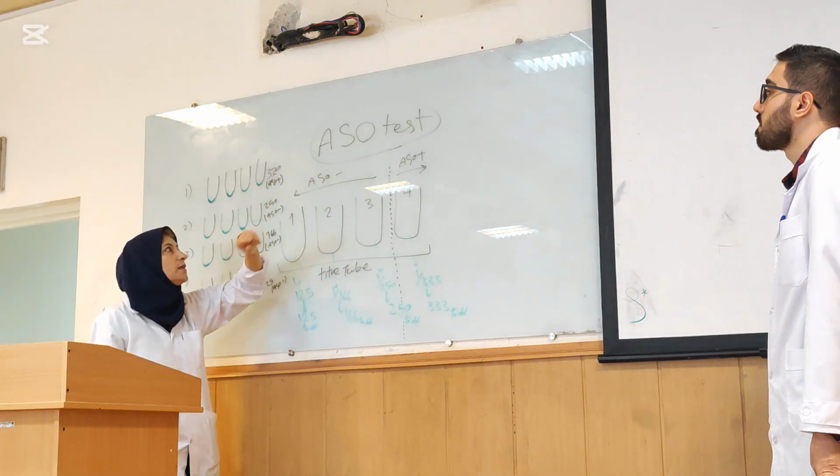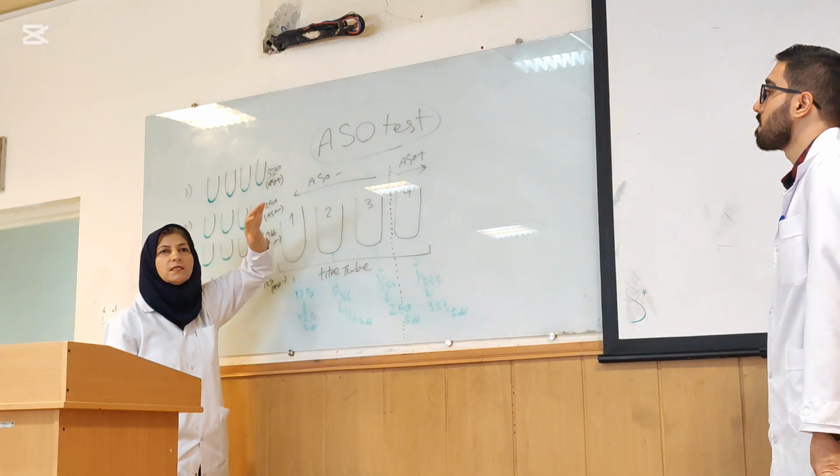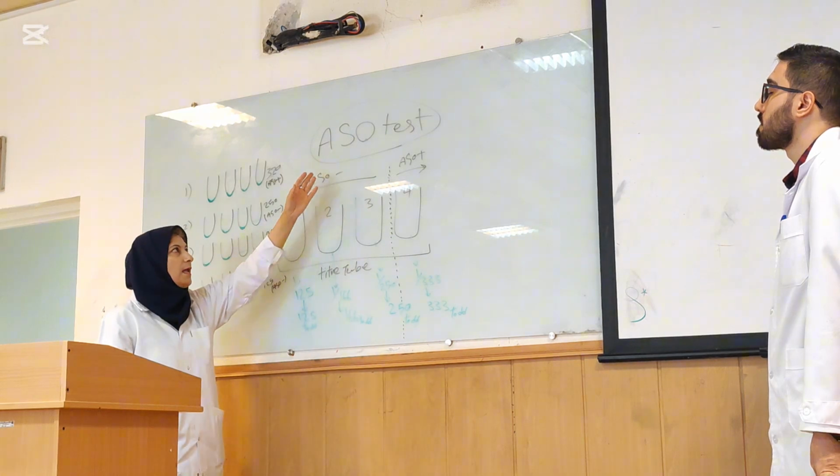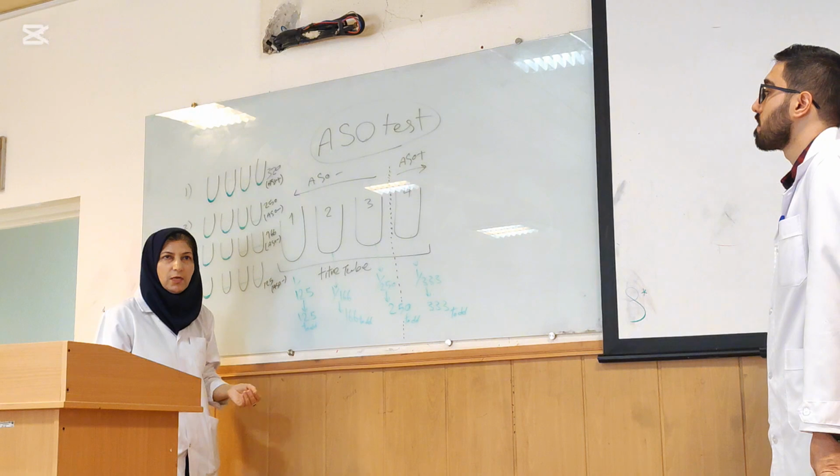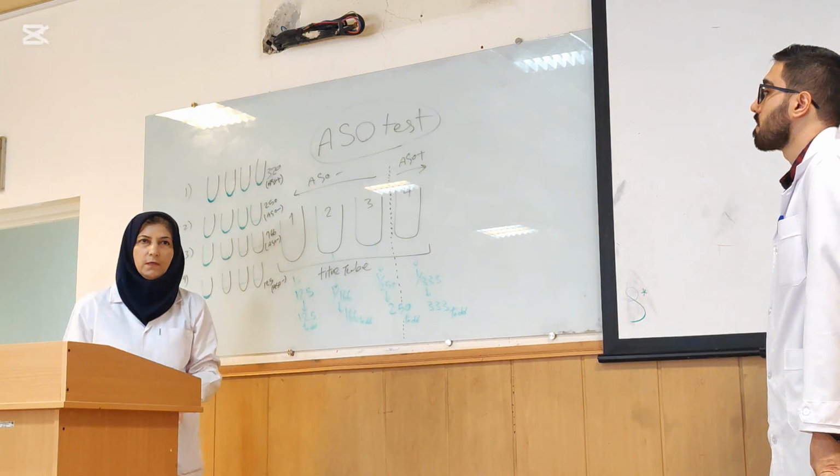You would be right if the basis of the ASO test were agglutination, but the basis of the ASO test is not agglutination, it is neutralization. Any question?